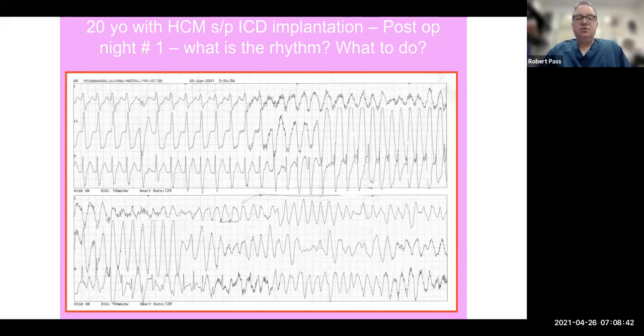The next thing that we do is we try to give the patient a chance to spontaneously terminate themselves. And so we will often set a wide range, at least the equivalent of 2 to 4 seconds of sensing in this arrhythmia. So that gives the patient an opportunity to potentially terminate on their own. But the other benefit of that is also that the device may not shock as much, right? Patient will come out on their own, and so we'll use less battery. So that's another benefit of a longer detection zone.